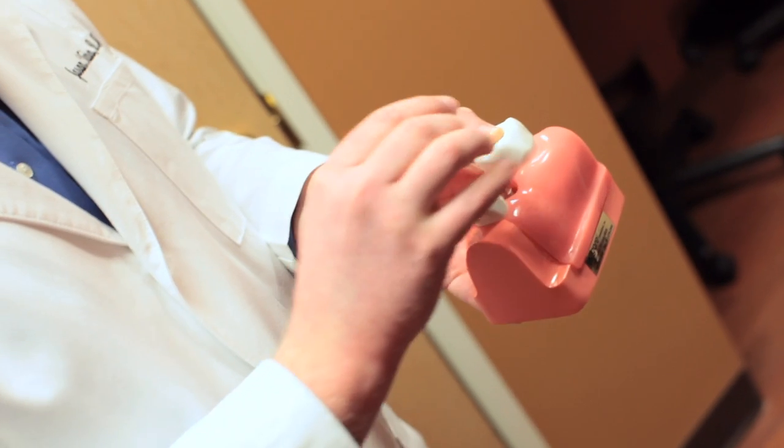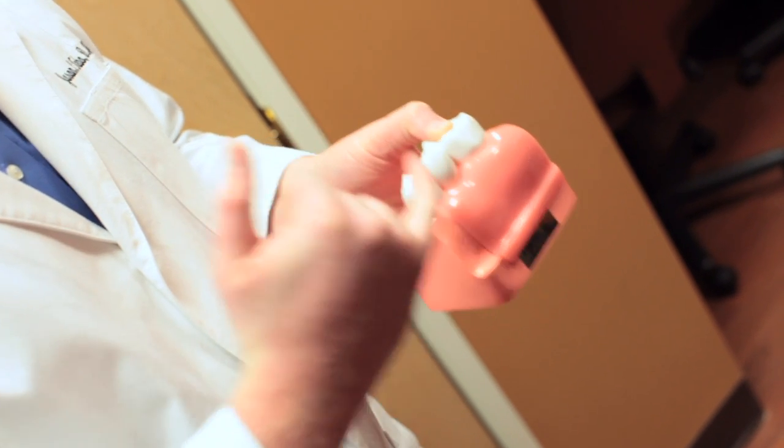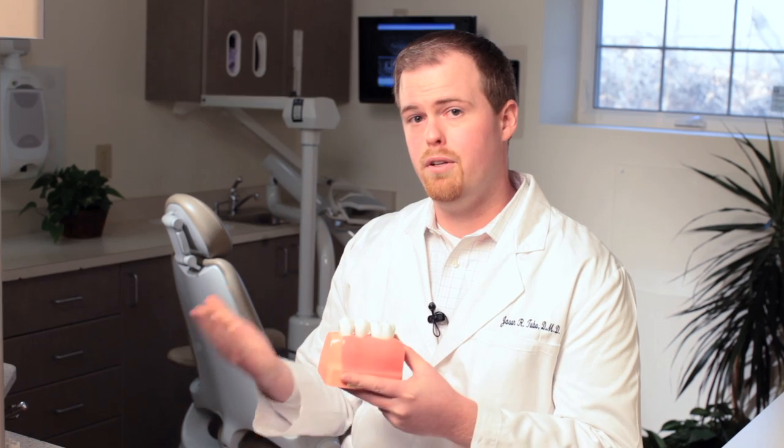Just like we need room on a tooth to put a crown over it, the abutment gives us the room for a crown to go over it — giving you something that looks, feels, and works just like your natural tooth. You can floss it, you can brush it, it doesn't come out at night, it's permanent.